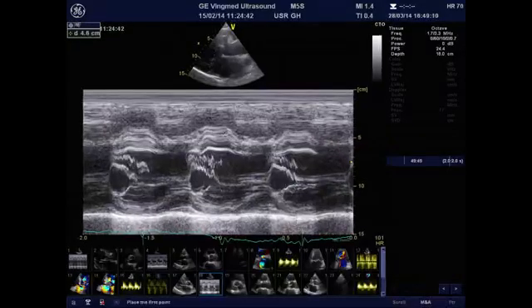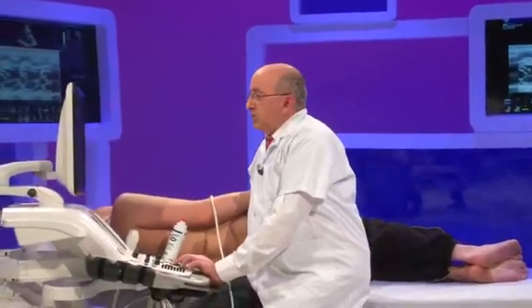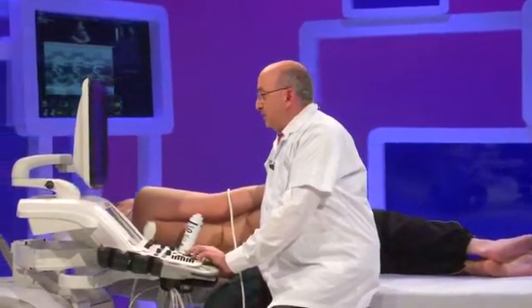And here we can observe, by M-mode echocardiography, a closure of the mitral valve occurring before the beginning of the QRS. So this is a sign of very elevated intraventricular pressures, indicating in general that the aortic regurgitation is severe and not well tolerated.